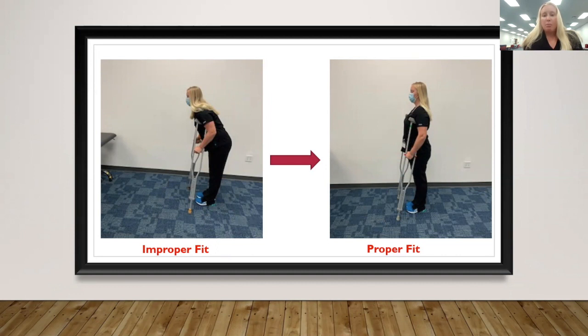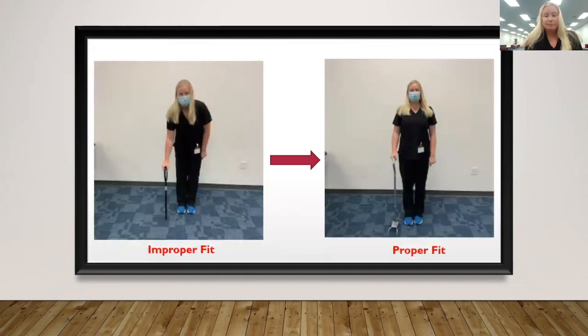When my arms are placed on the device, I am able to have a 20 to 25 degree bend in my elbow. And further, if you were to assess under the axillary region or the armpit region, you would be able to have enough to fit 2 to 3 finger widths. So that is avoiding axillary compression and compression of very important vessels and structures.